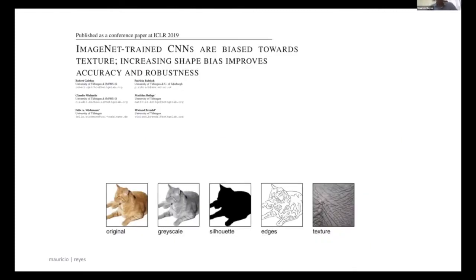Now, let's go back to texture. And why is this important in the context of interpretability? We analyze texture as well in medical images. For example, vascularity of a tumor, we associate that with texture information, right? When we move from one vendor to the other in a CT scan, the reconstruction kernel changes because you want sharper images, and that will modify your texture. If you move from one device to the other in an MRI, that will modify your texture information. Therefore, that can bias your system.